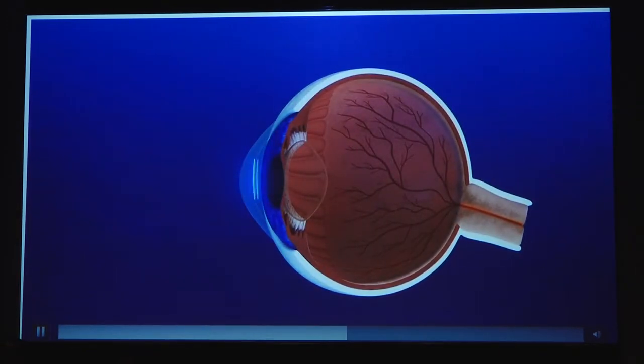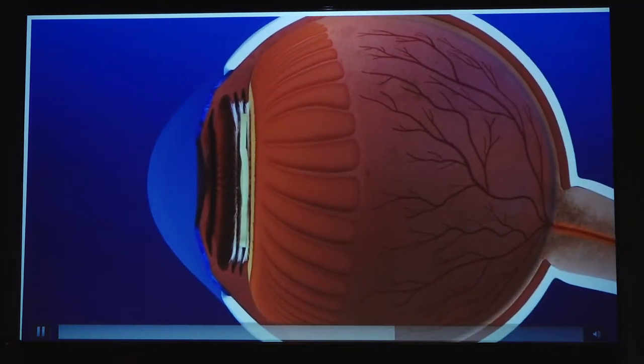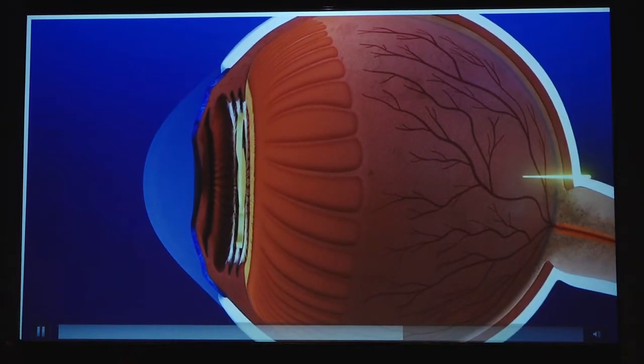With presbyopia, the focused light falls behind rather than on the retina when looking at close and intermediate objects. The slightly elevated smooth plateau is responsible for stretching the focal range.